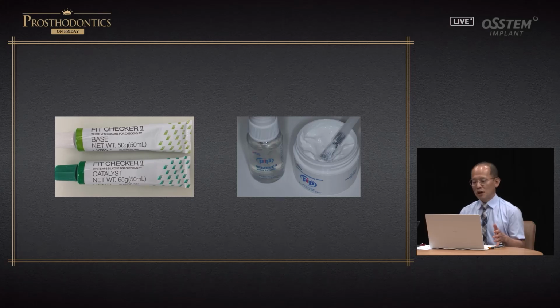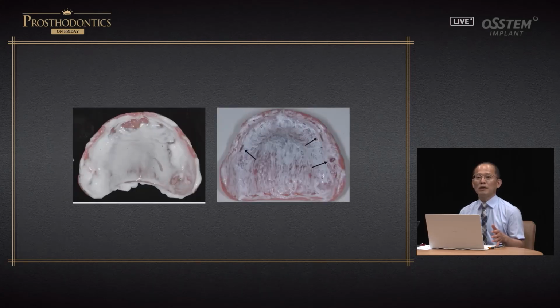As you see in this slide, on the left side, fit checker is silicone in material. So base and catalyst, if you mix them together until there is polymerization, there is a certain thickness. But the issue here, on the upper side, if you cover the whole maxilla, the excess is closed and kept in there. So that's not good. So you should not use it on the maxilla overall. PIP is the only one, because it's a cream.